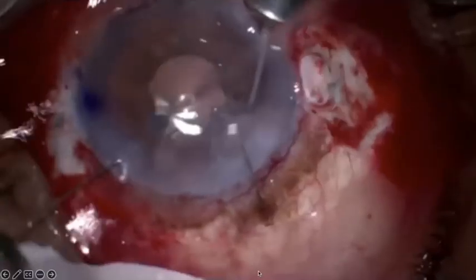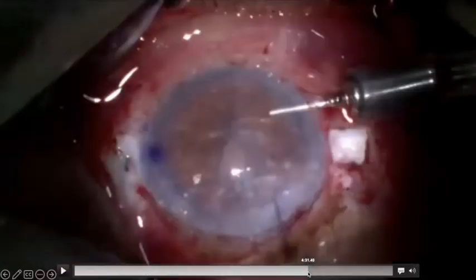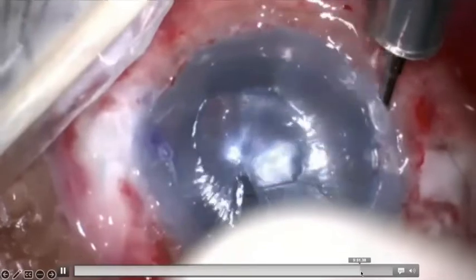Now the pupil has become a little irregular because of the iris hooks that were used. So we're going to do a pupilloplasty just to make the pupil round again. And once the pupil is made round, we go ahead and do the PDEK and put in the graft, and the patient, you can see, looks much better.